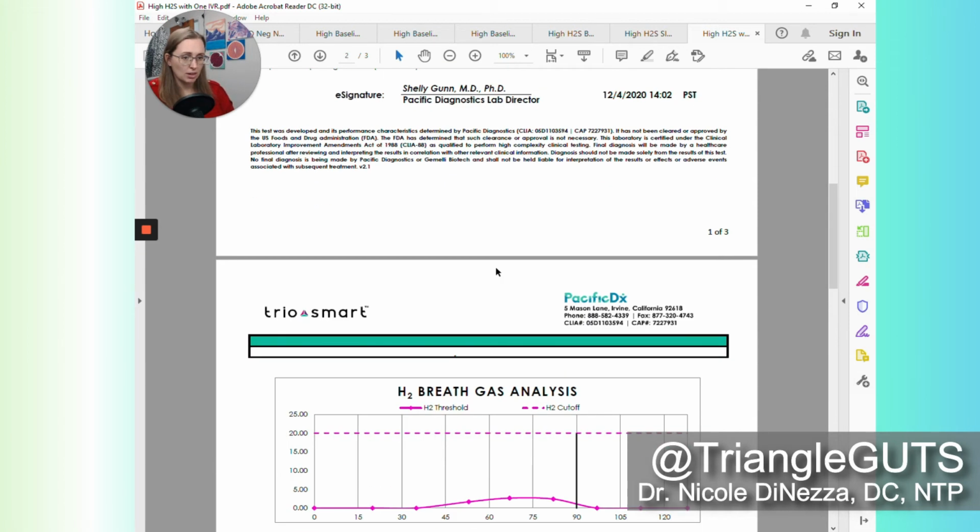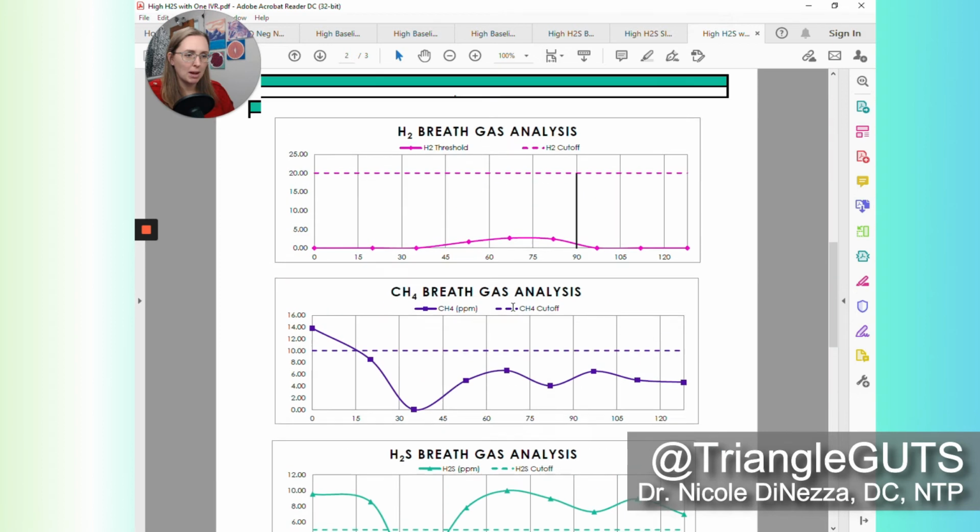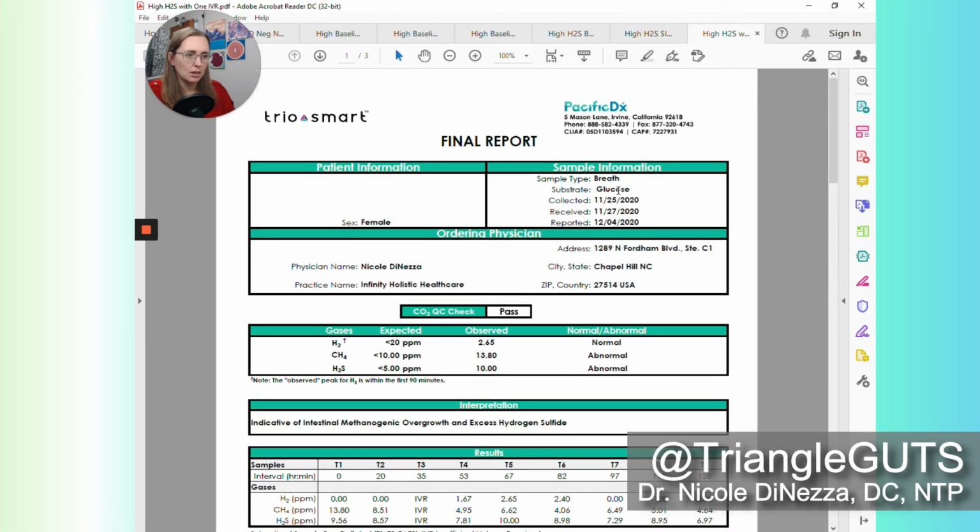So this is a patient, I remember her sample. I told her I do think she has SIBO. I just think that we've reached the cutoff point where the lab is able to measure hydrogen sulfide. And I think that if we had a little bit more wiggle room going up, she truly has SIBO. And a lot of her symptoms made sense for SIBO. And keep in mind, too, that, like I said, glucose is going to be a little bit better than lactulose for the false negatives, false positives thing. But you're still going to get a lot of false negatives and positives with any sort of SIBO breath testing. And that's just the way the cookie crumbles, unfortunately.